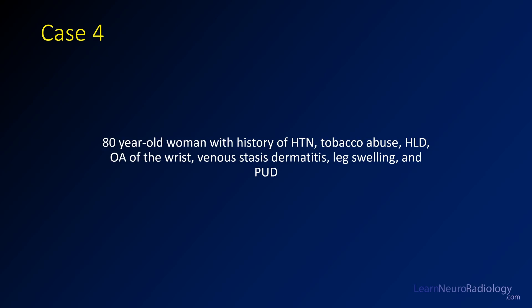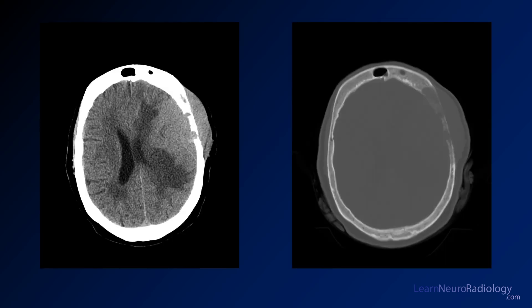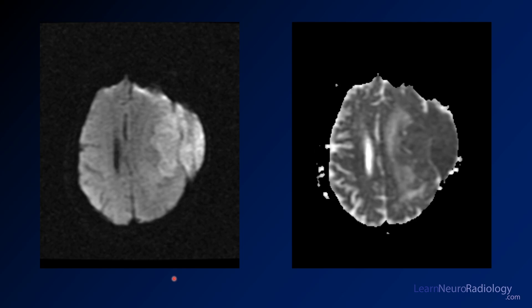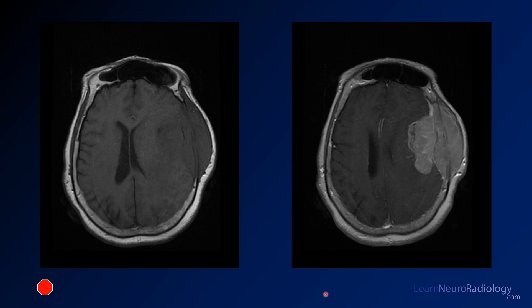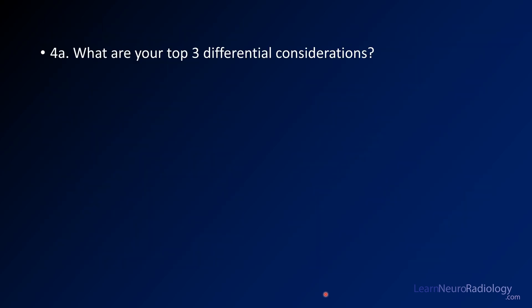Case four is an 80-year-old woman with multiple medical problems. We see images from a CT of the brain in the brain window and then also in the bone window. The patient went on to have an MRI — this is DWI on the left and ADC on the right, T2 on the left and FLAIR on the right, and pre and post contrast images. By now you should be thinking about your potential diagnoses — this is a differential case, so what are your top three differentials?